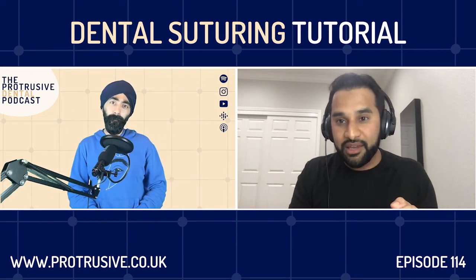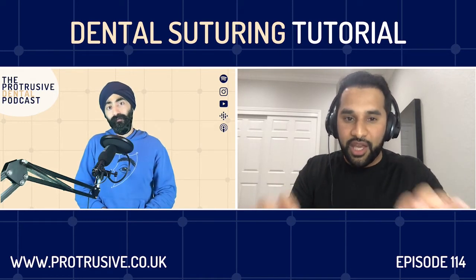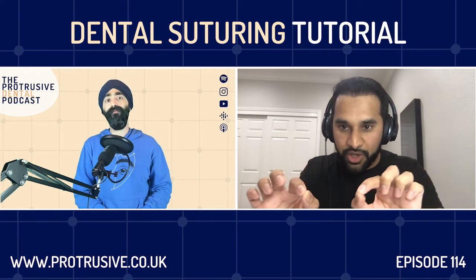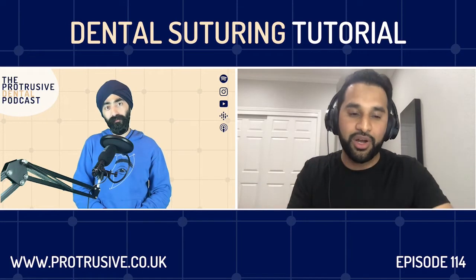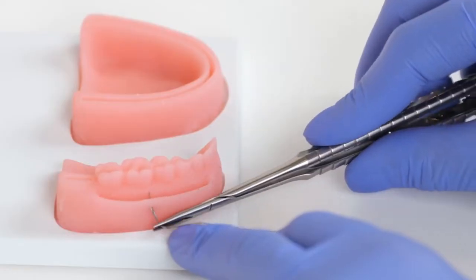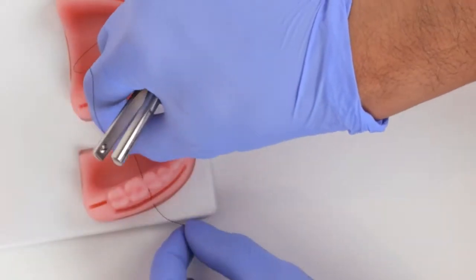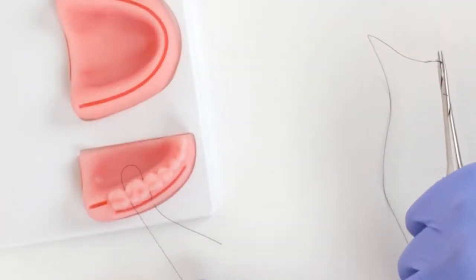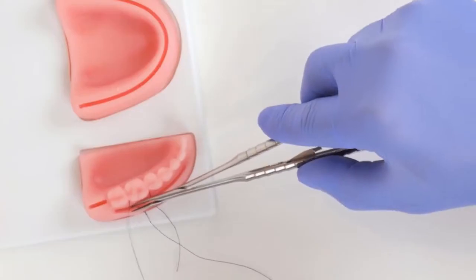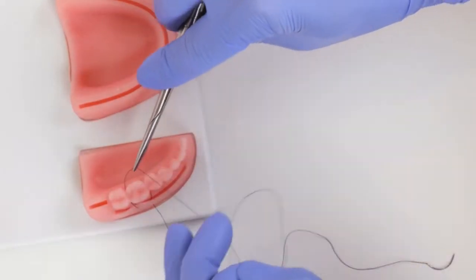Generally, whenever I'm laying a flap, tissue back against the teeth, and you want to move the papilla exactly where you want them to go, with that type of approximation, I look to a sling suture, or the continuous sling. You have so much control over how the papilla get laid down. Amazing. And you cover that in the course, right? It's definitely in the course. It's a great suture. It is a little tricky.